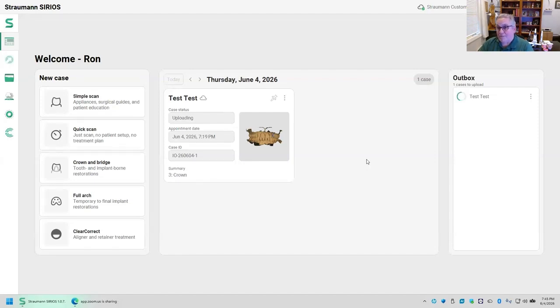They ensure that you have the emergence profile, because the emergence profile is created by that scannable abutment, and you simply have to scan the top of it, okay? And then the laboratory extrapolates what the emergence profile is from that. And many implant companies now have those. Certainly we do, and many others do. And the workflow here in the software, exactly the same. You just won't be using a scan body. You'll just run over the healing abutment the second time.